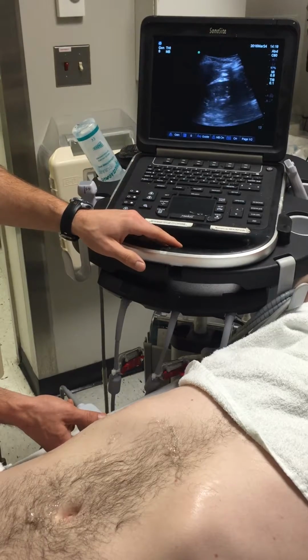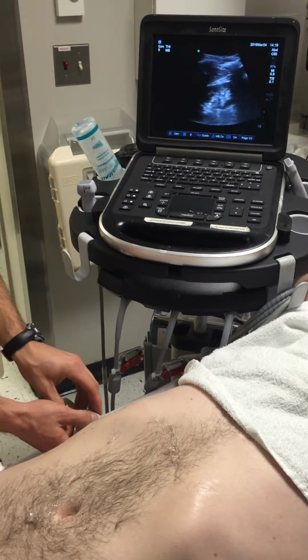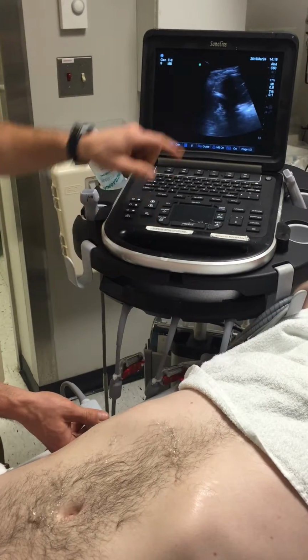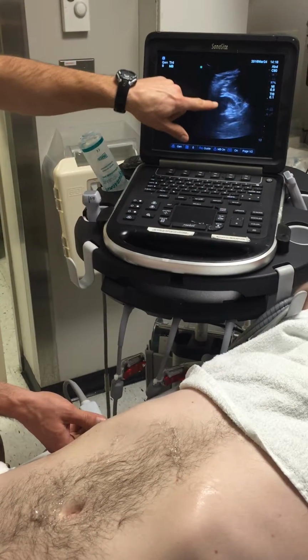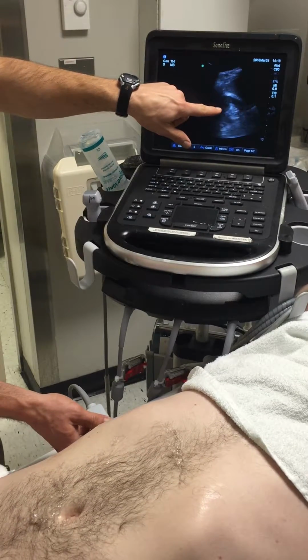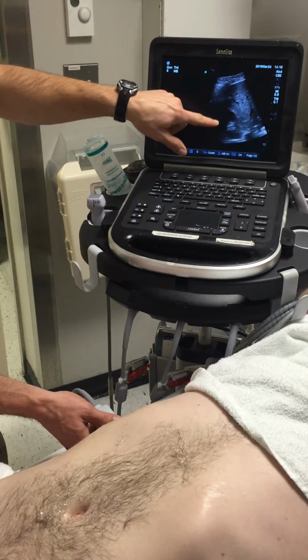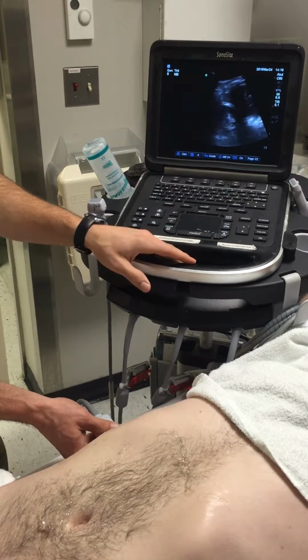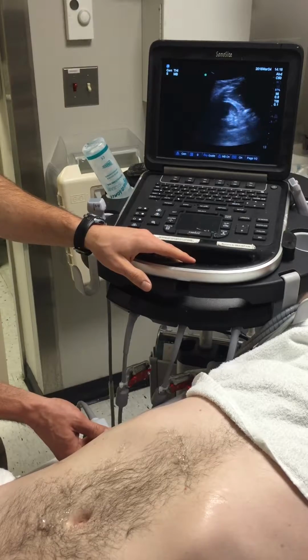So you fan through in a long axis, and then you turn the probe, and now you put the indicator typically towards the back, and now you can see it's more circular, and then you fan all the way from the inferior pole up to the superior pole. These are rib shadows. Sometimes you got to work around them. A breath can help with that if needed. A lot of times just being patient and you'll get the view you need.